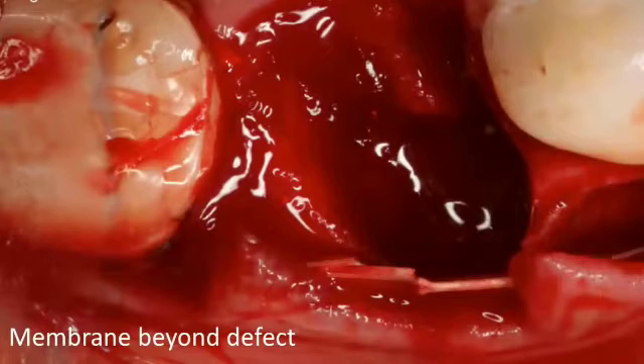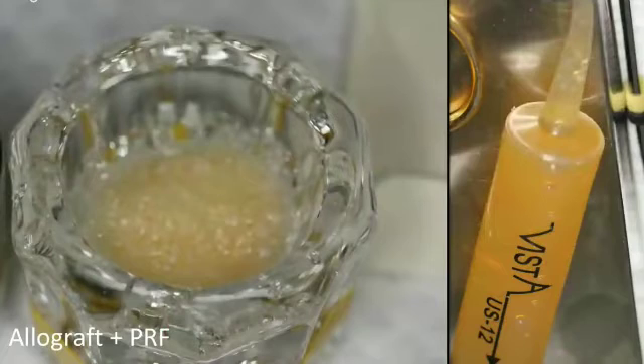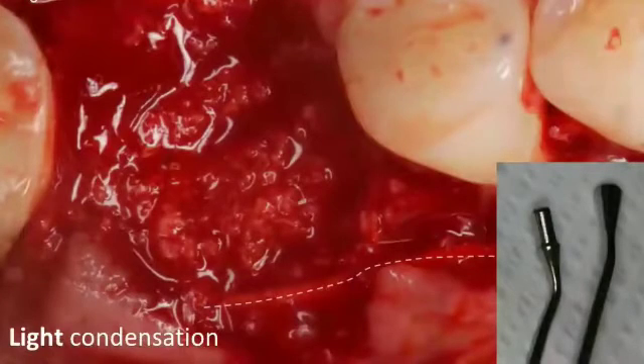Place your membrane beyond the defect. In this case, I placed at least two membranes because the deficiency was large. After you've debrided the socket and used saline irrigation, you've completed the buccal wall using the compartment technique with one or two collagen membranes. If you're using PRF, you can add a PRF membrane as well. Then use the bone graft of your choice — here I'm using an allograft material mixed with platelet-rich fibrin and some antibiotics — and condense it in the socket.